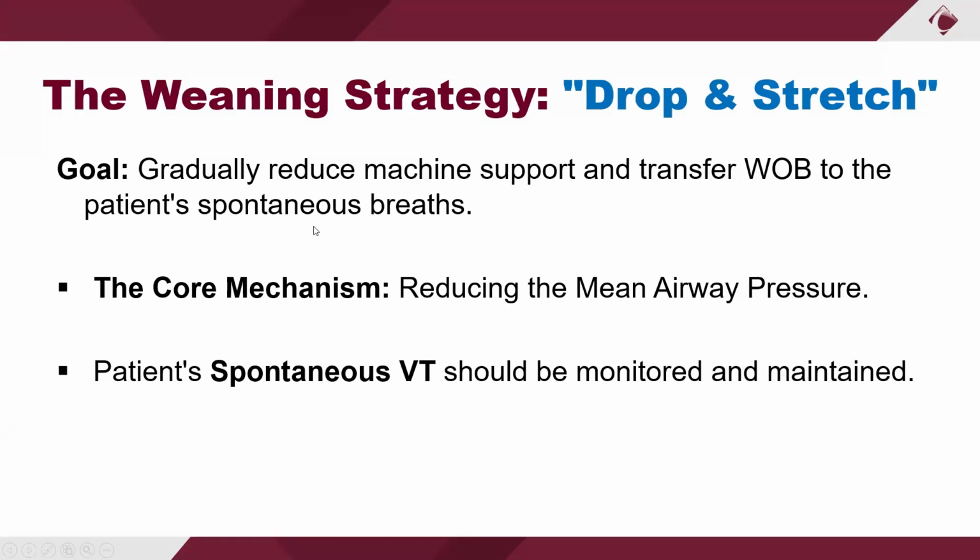So again, let's talk about drop and stretch. Am I doing okay on time? Okay. So this is a coined term from what Dr. Habashi originally published in the paper in 2005 about this mode.